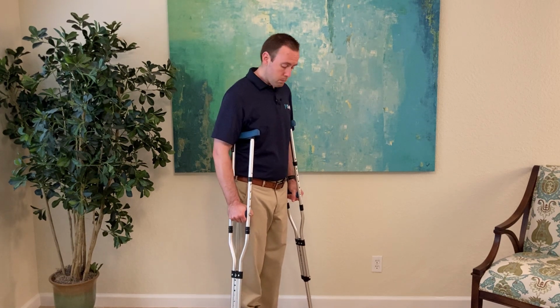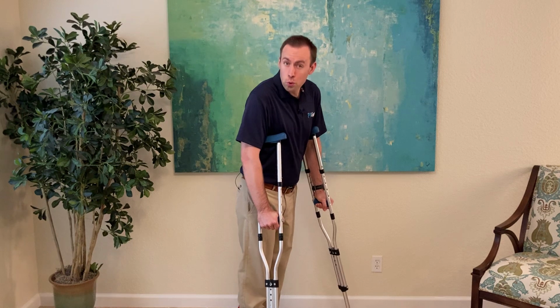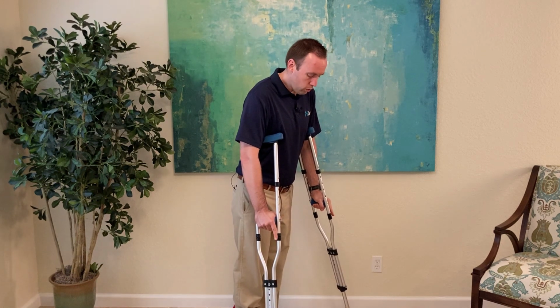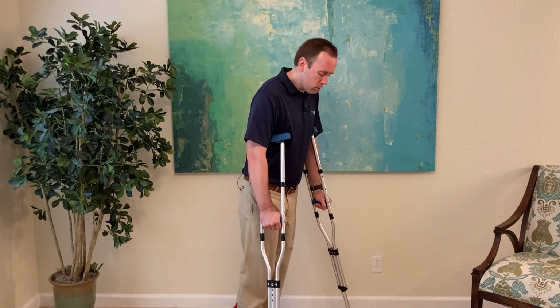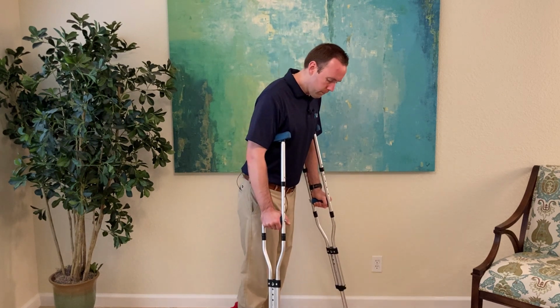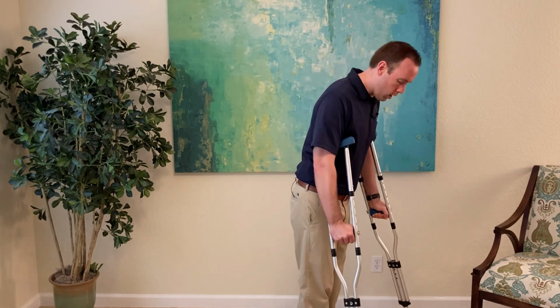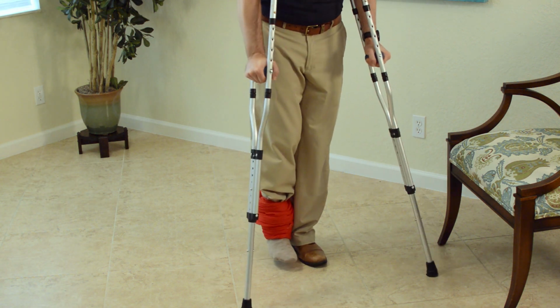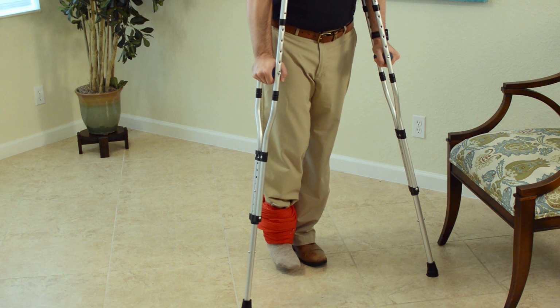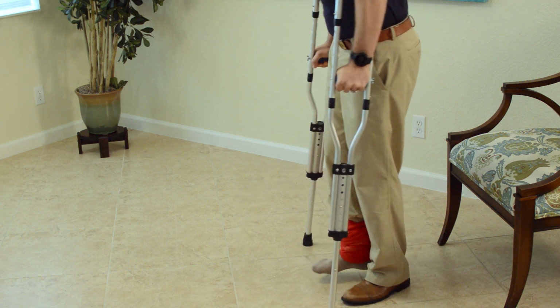So you can start just by going crutches, and then you're going to hop to the points of the crutches, not too far forward past the crutches, because then it's going to throw your balance backwards. So it goes like this. You push your weight through your arms, and then left leg, or the good leg, okay? Crutches, arms straight down, good leg. Crutches, arms straight down, bear the weight, good leg. Turning, same thing, all right?